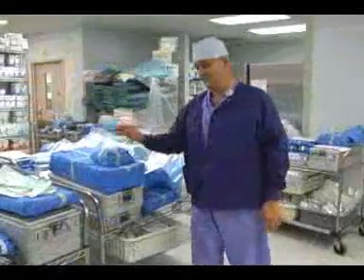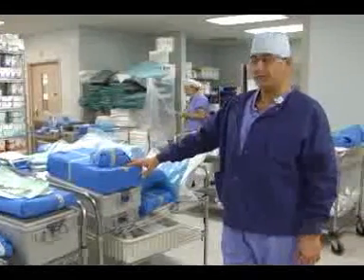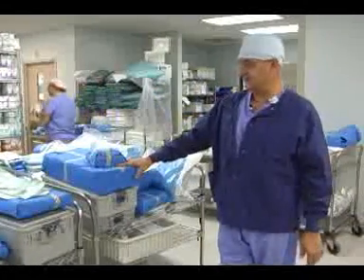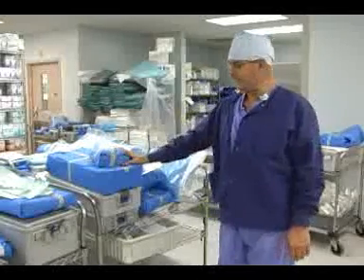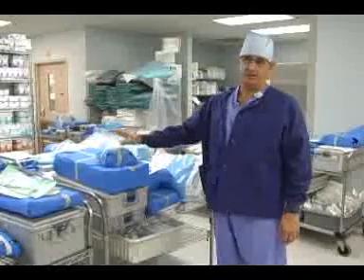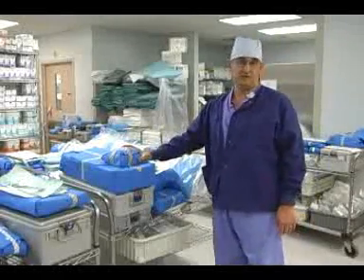Hi, my name's Eric. I work here at Frederick Memorial Hospital. These are case cards for each case that we have to be done today. They come up from downstairs in our sterile processing. They've all been sterilized and are wrapped, and we have various indicators that show us that they're sterile.